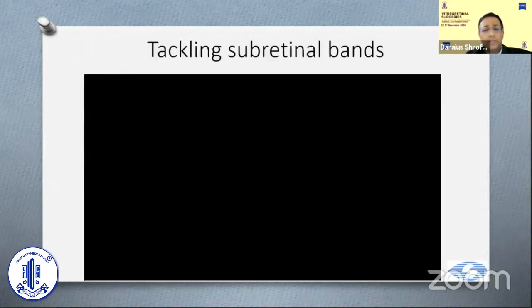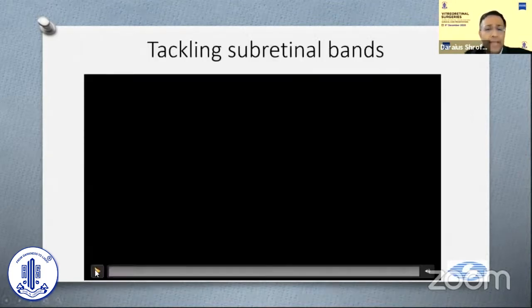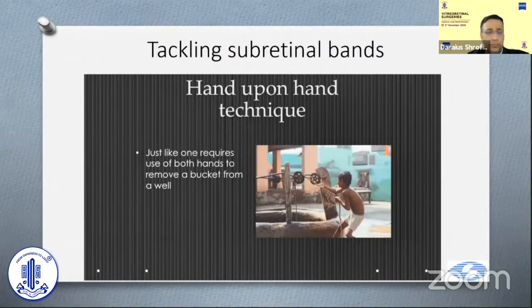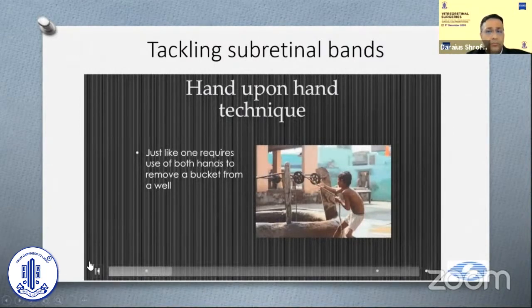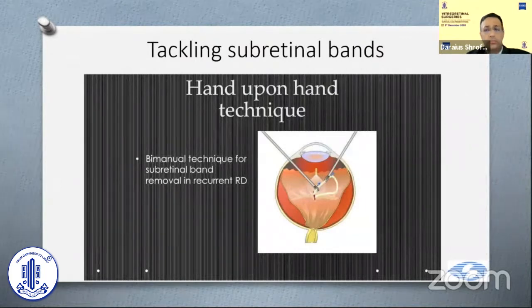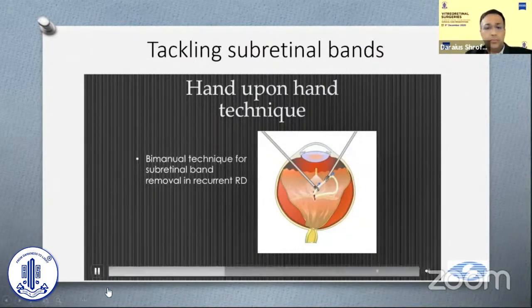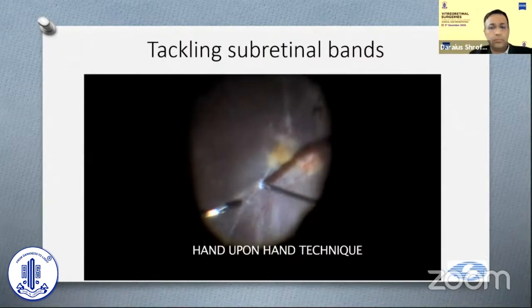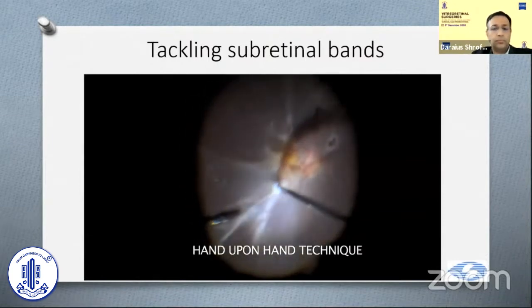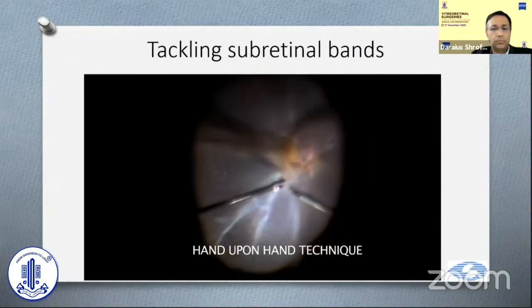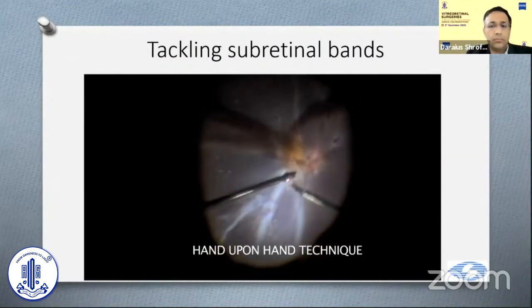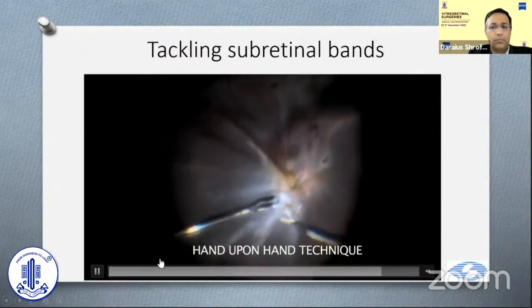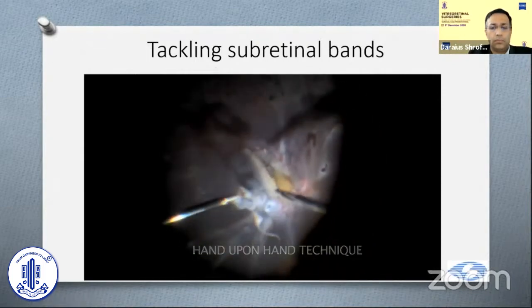A few tips and tricks for tackling subretinal bands: this is the hand-upon-hand maneuver. Inspired by vitreoretinal surgery, analogous to pulling a bucket of water out of a well, we depict a bimanual technique for tackling subretinal bands in recurrent RD based on the same principle. In this 24-year-old boy with recurrent RD, we carefully chose the point of retinotomy at the site of confluence of the subretinal band and marked it with endodiathermy. We then entered the subretinal space with end-gripping forceps and bimanually removed the band atraumatically using the hand-upon-hand technique.